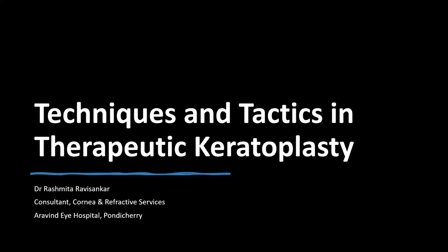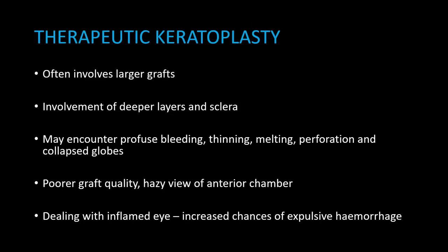So this is going to be a video-assisted skill transfer video, basically focusing on the steps of therapeutic keratoplasty and aimed at the fellows and budding surgeons. So, arguably, the most important surgical intervention while treating infectious keratitis is therapeutic keratoplasty. And how well you execute a therapeutic keratoplasty can dictate the prognosis for the patient's vision in the future, how good the eye is going to be to receive an optical graft in the future.